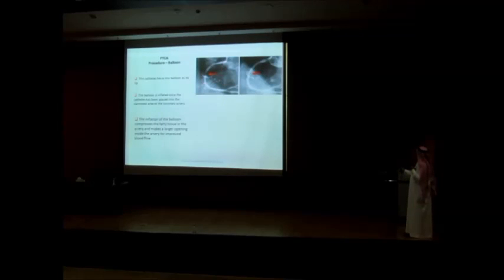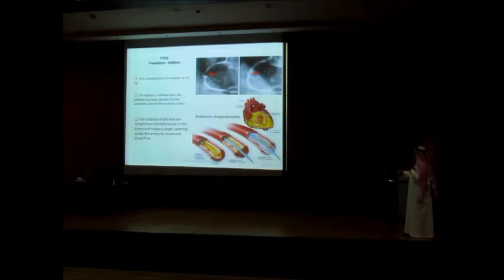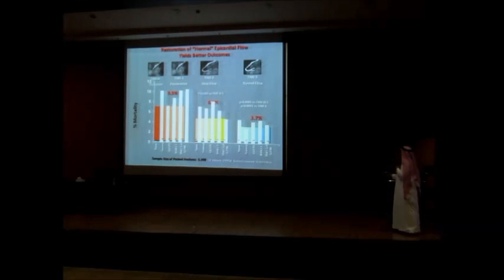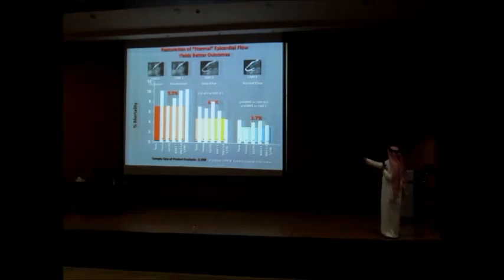So this patient came with right coronary artery occlusion, went to the cath lab and got stents. Right? He was treated. So this is balloon angioplasty, and now it's not called angioplasty, it's called percutaneous coronary intervention, PCI. The aim is, this is the artery, this is the contrast, the white thing, and the artery is not really perfused by blood. So this is thrombolysis in myocardial infarction flow zero.